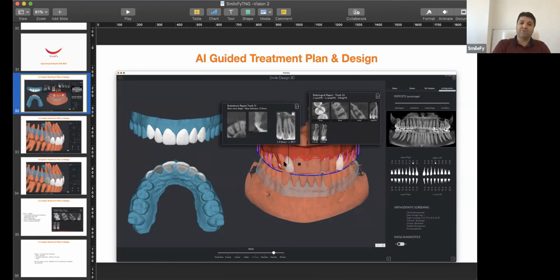And that brings everything that we do to a different level, because suddenly we don't guess. Suddenly I don't have only veneers. I have the treatment behind the veneers, and everything is done automatically by the system.